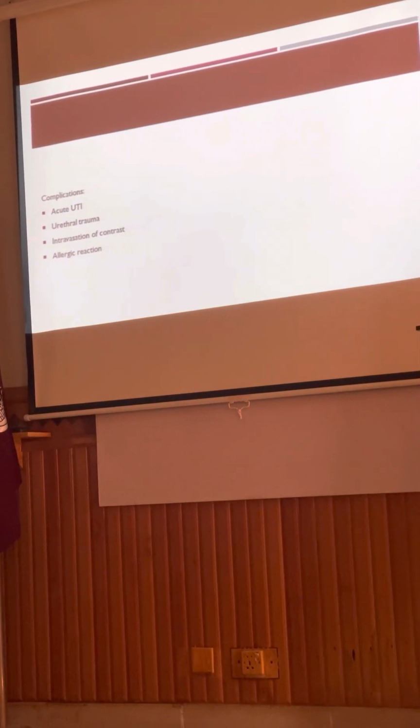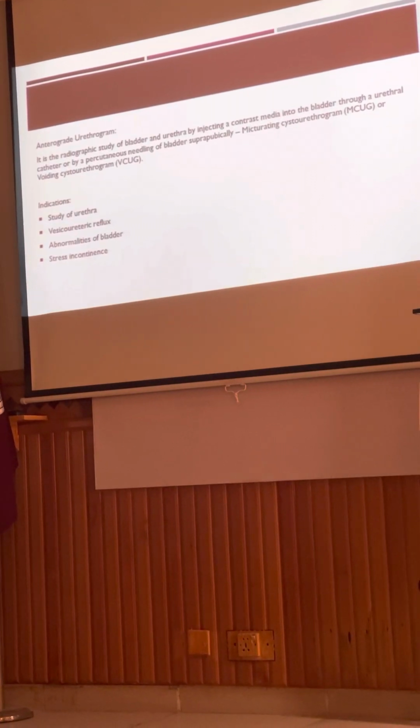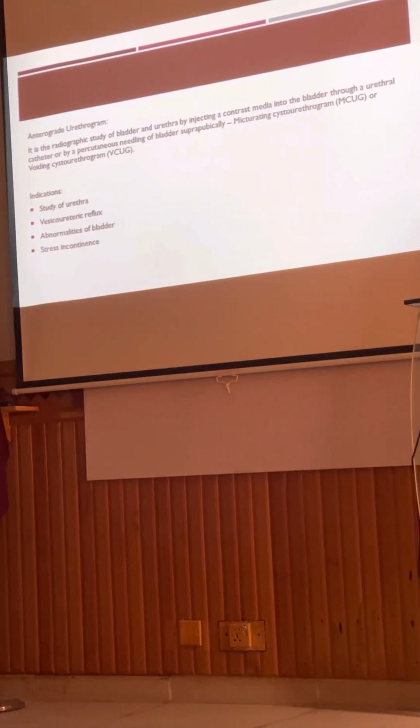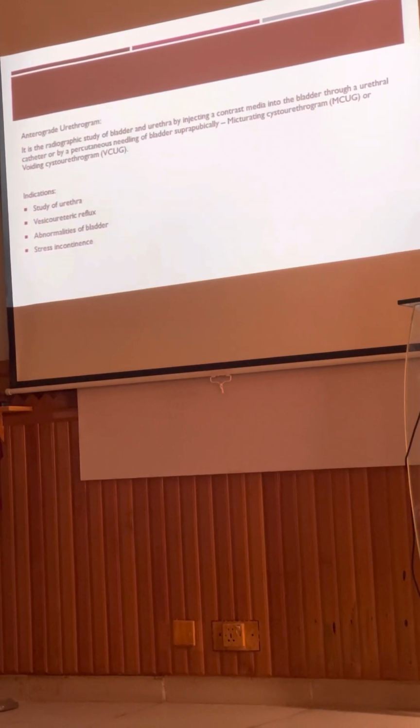The allergic reaction is already explained. So the previous discussion was about the retrograde urethrogram, and now we are going to discuss the antegrade urethrogram.